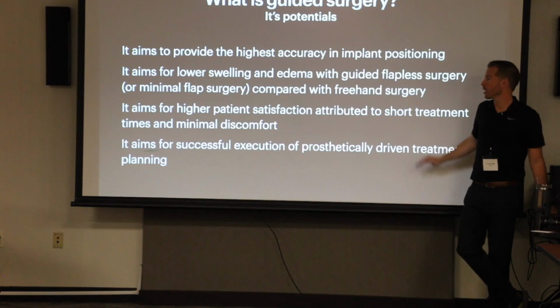And then it aims for prosthetically driven dentistry. So we're planning depth of placement, screw hole access, thinking crown and bridge, or thinking restorative in mind.